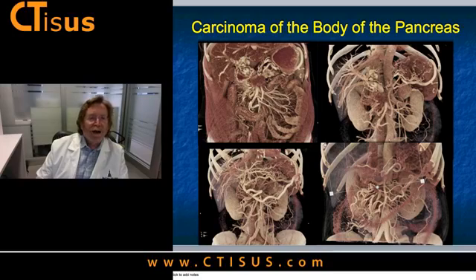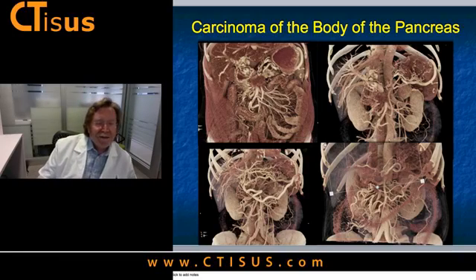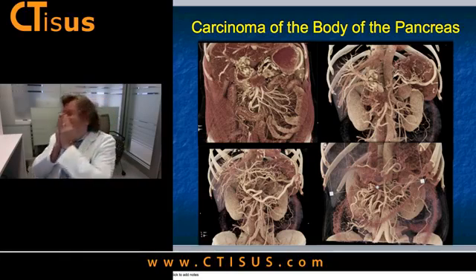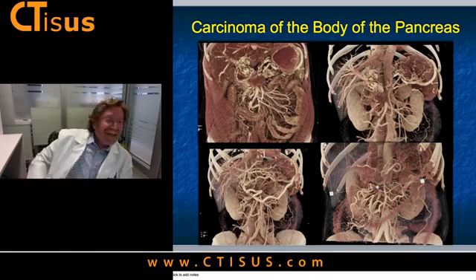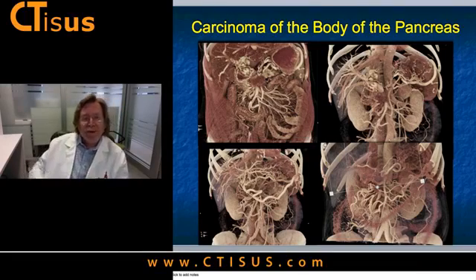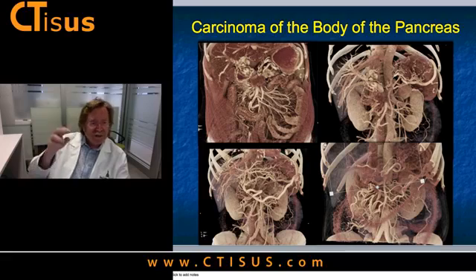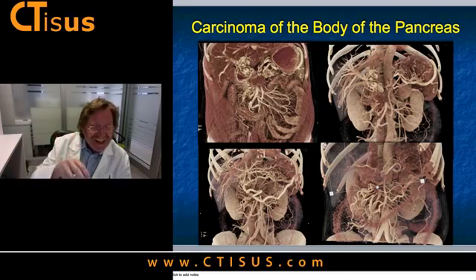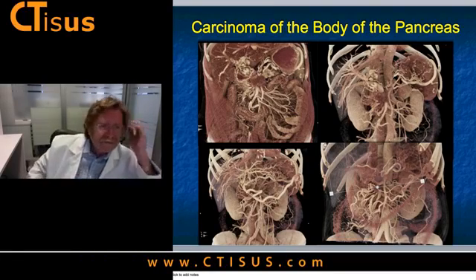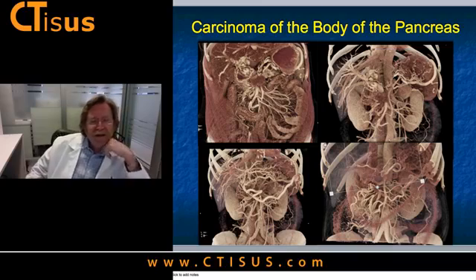I don't want to go through the detail, but cinematic rendering is a form of volume rendering. Remember, one of the big things about volume rendering initially was that it was a single light model. You could adjust it, and that's what gave a lot of the depth perspective and the 3D perspective. Now, with cinematic, what you're doing is having multiple light sources.